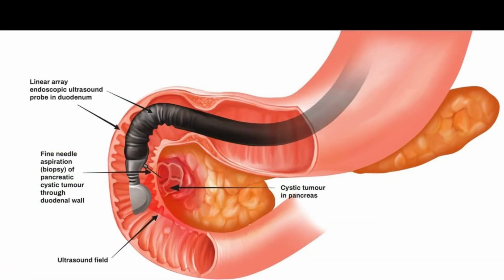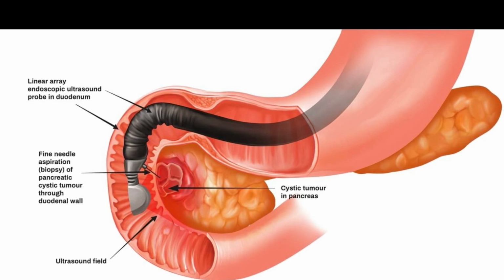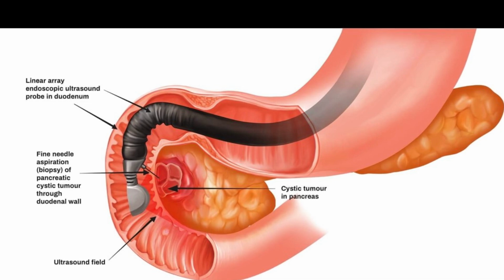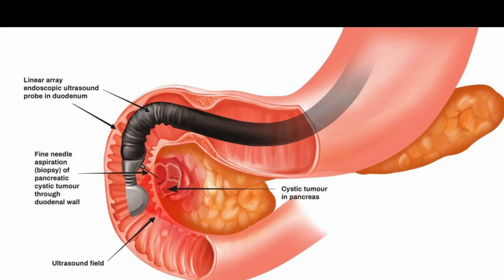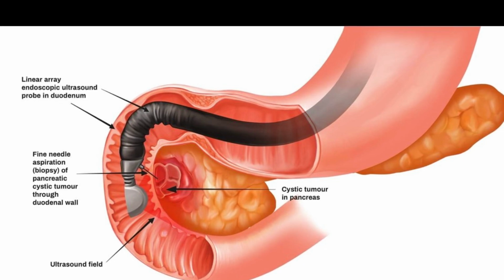In this picture, we're looking at where the scope is being placed, and we can see where we're using the fine needle aspiration in order to conduct a biopsy on this patient, so that we can get it sent off to pathology for further review.